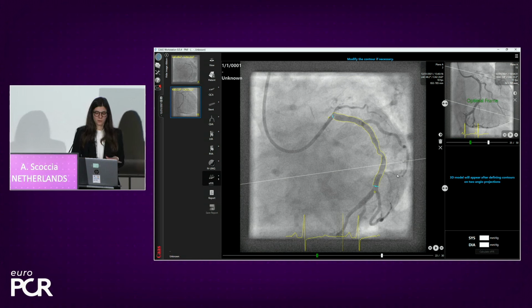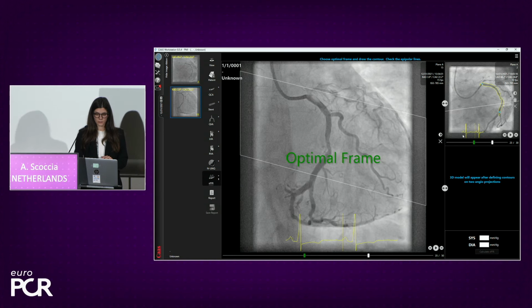And third, just finish the analysis in a vessel with a diameter over 2 millimeters. I mean, in a vessel that you would consider to stent. Because otherwise, if we finish the analysis in a very small vessel, of course, maybe the VFFR value will be lower, but we couldn't really do anything about it. So 2 millimeters is the kind of threshold that we used.